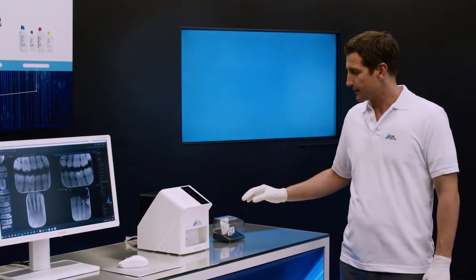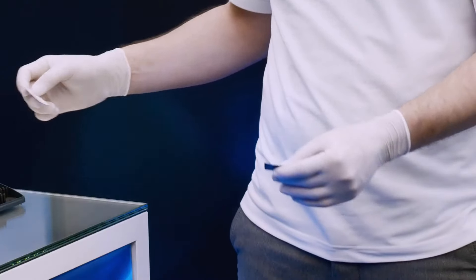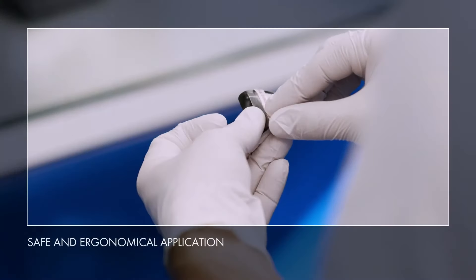VistaScan Image Plates IQ are available in the intraoral sizes S0 to S4. Dürr Dental original accessories ensure safe and ergonomic handling.